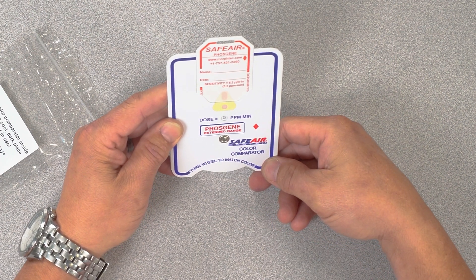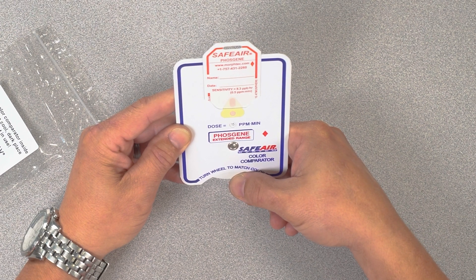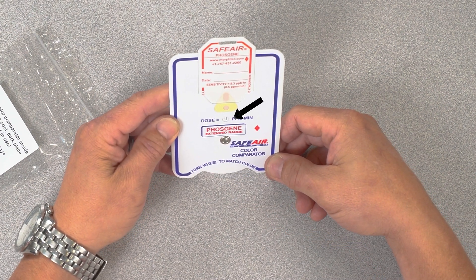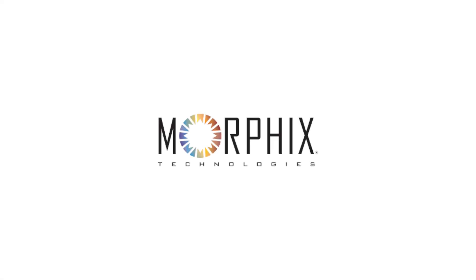Once you have confirmed this shade is darker than the badge, spin the wheel back to confirm exposure dose readout, which can be read in the circle on the comparator. Remember, SafeAir badges, in conjunction with the color comparator, allow users to quantify the exposure dose on the badge. Visit MorphTech.com to learn more about SafeAir badges and color comparators.